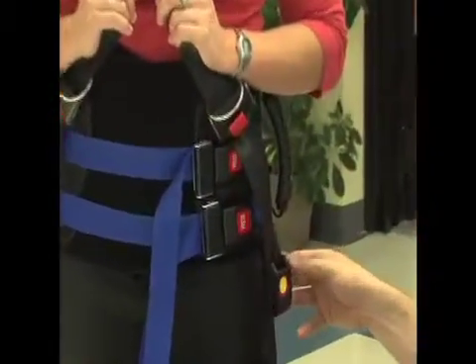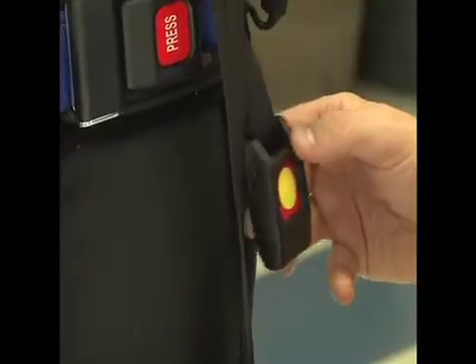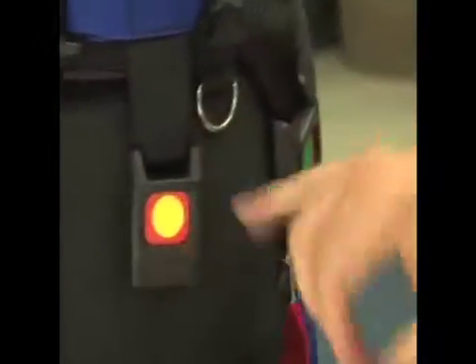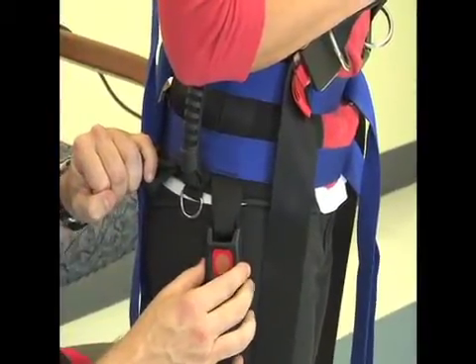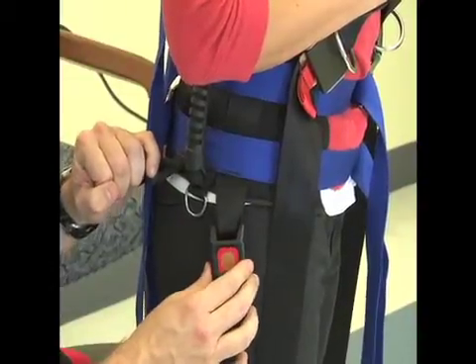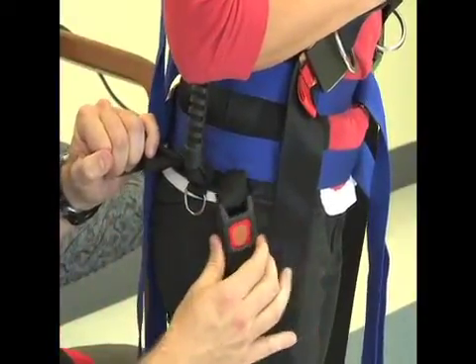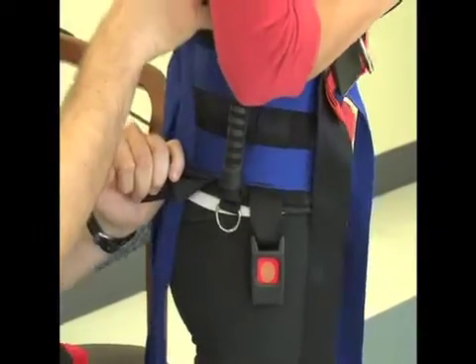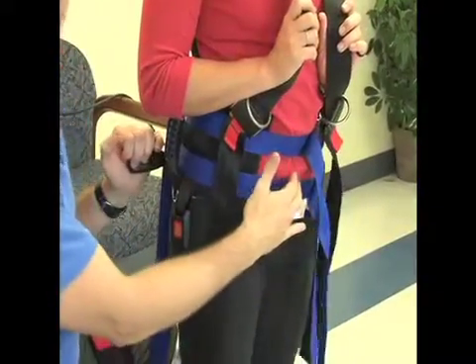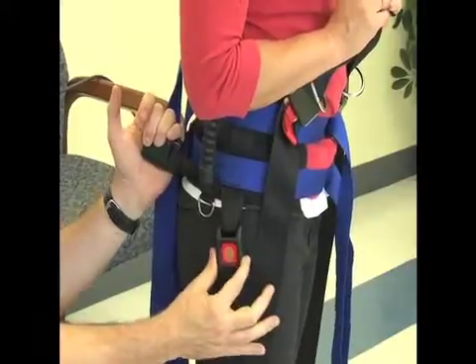To tell if the vest is on correctly, take a look at this anterior buckle that faces downwards towards the floor or down the person's thigh. This buckle right here should line up with the greater trochanter. If the buckle is too far anterior, you need to make adjustments to the vest by tightening the straps in the back and loosening the straps in the front, which will bring the buckle over the greater trochanter.